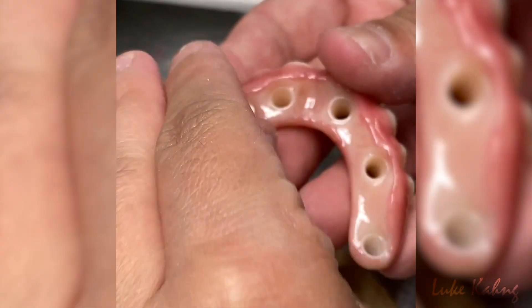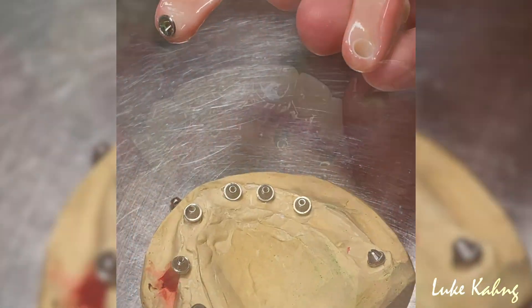Once baked again, the implant screws are placed and cemented into the holes of the arch.